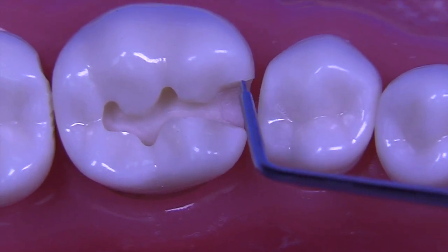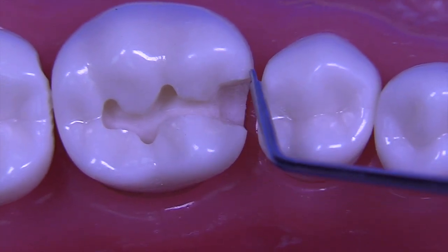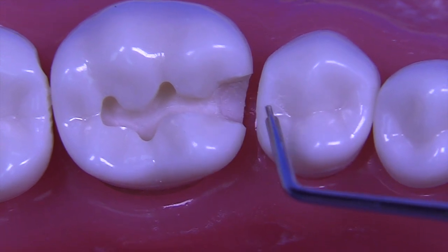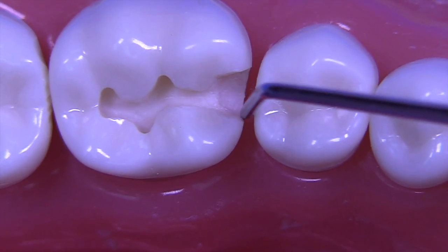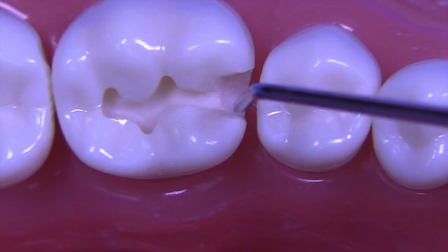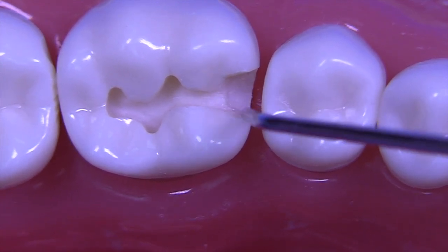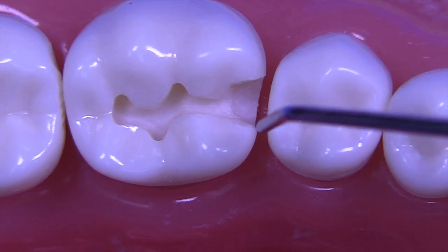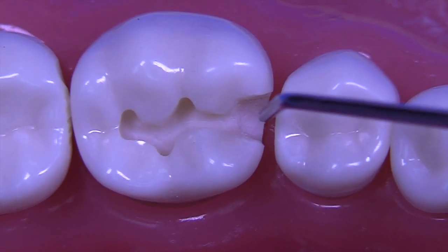Let's refer back to the flow and the way these are angled. The angulation here shows that the angle will be slightly obtuse, and on the lingual side, the angle appears to be very nice. It's a little bit wobbly, but it's pretty nice. So slightly obtuse, pretty much close to 90 degrees or 91 degrees, which is what I like to shoot for, not 90, so that we don't leave any undermined enamel.